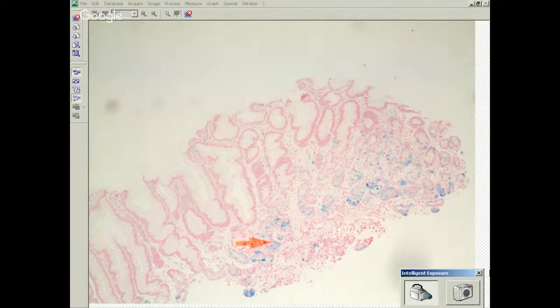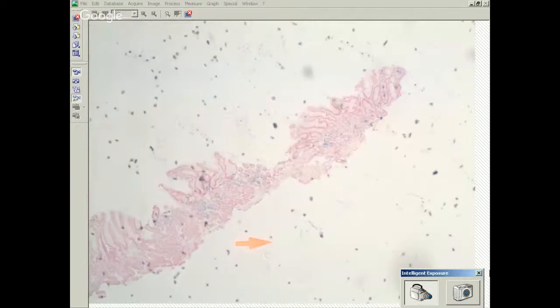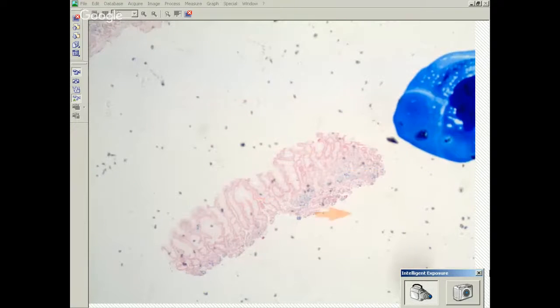And the mechanism for gastric siderosis is not well understood because usually when you have iron overload, it tends to affect the liver and the pancreas and heart first, and it's less likely to affect the stomach. But it's something to keep in mind if you get some funny stain pigment, work it up. So yeah, it's generally inside the cells as opposed to in the lumen.